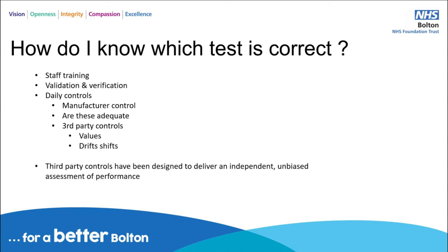And then how do we give them evidence? When we're responding to the freedom of information, how do we know that the correct test is correct? So the first thing that we would always do is staff training. Who's done the training of the test that's in place? Look at the verification, validation.